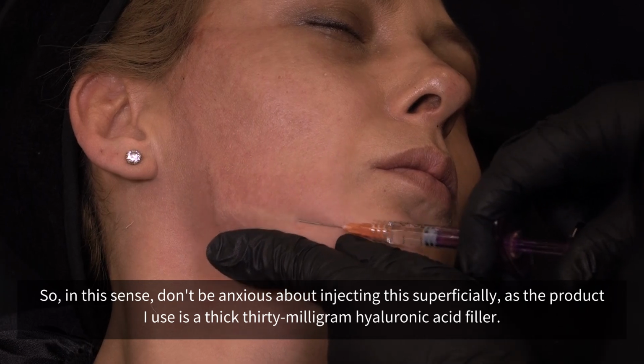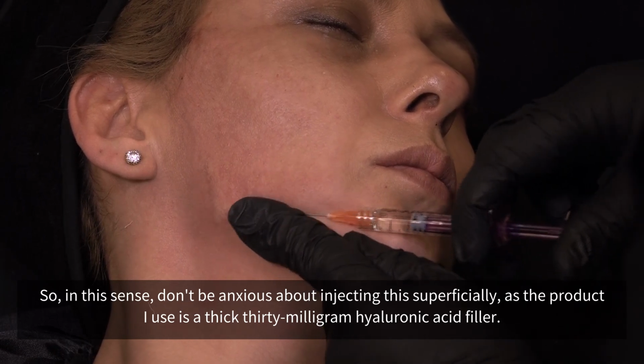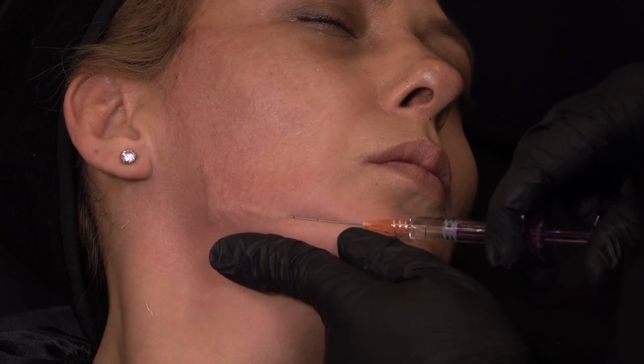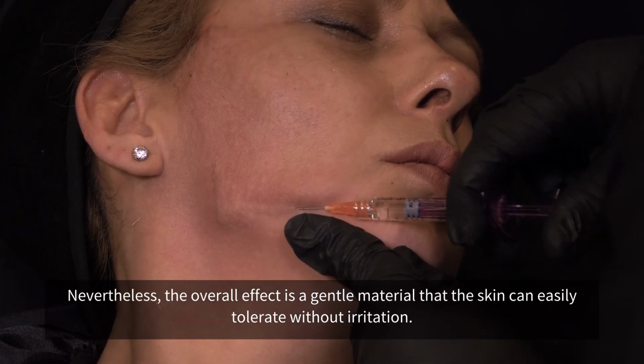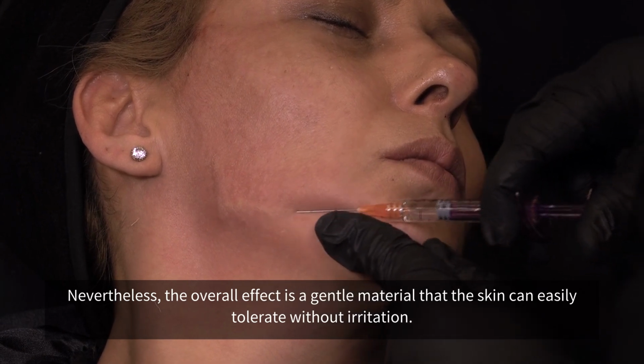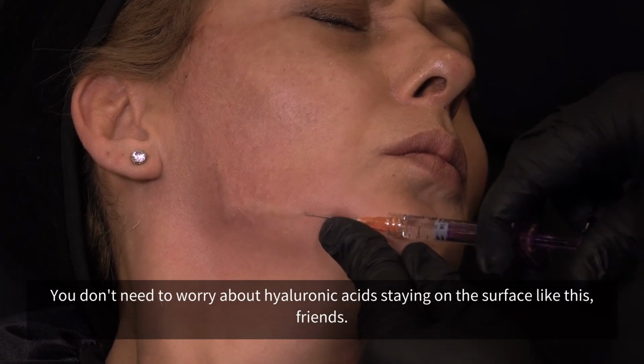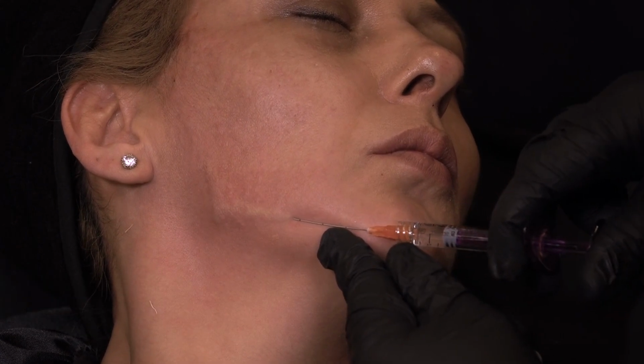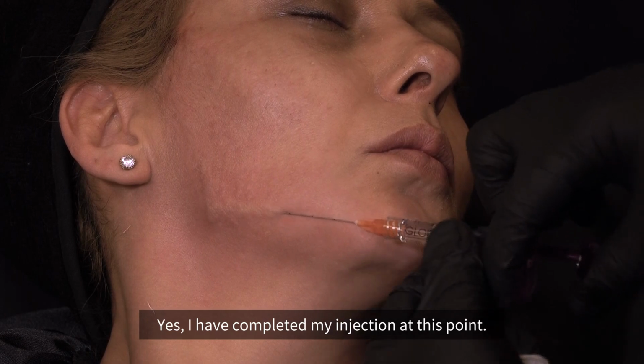So in this sense, don't be anxious about injecting this superficially, as the product I use is a thick 30 mg hyaluronic acid filler. Nevertheless, the overall effect is a gentle material that the skin can easily tolerate without irritation. You don't need to worry about hyaluronic acid staying on the surface like this, friends. Yes, I have completed my injection at this point.